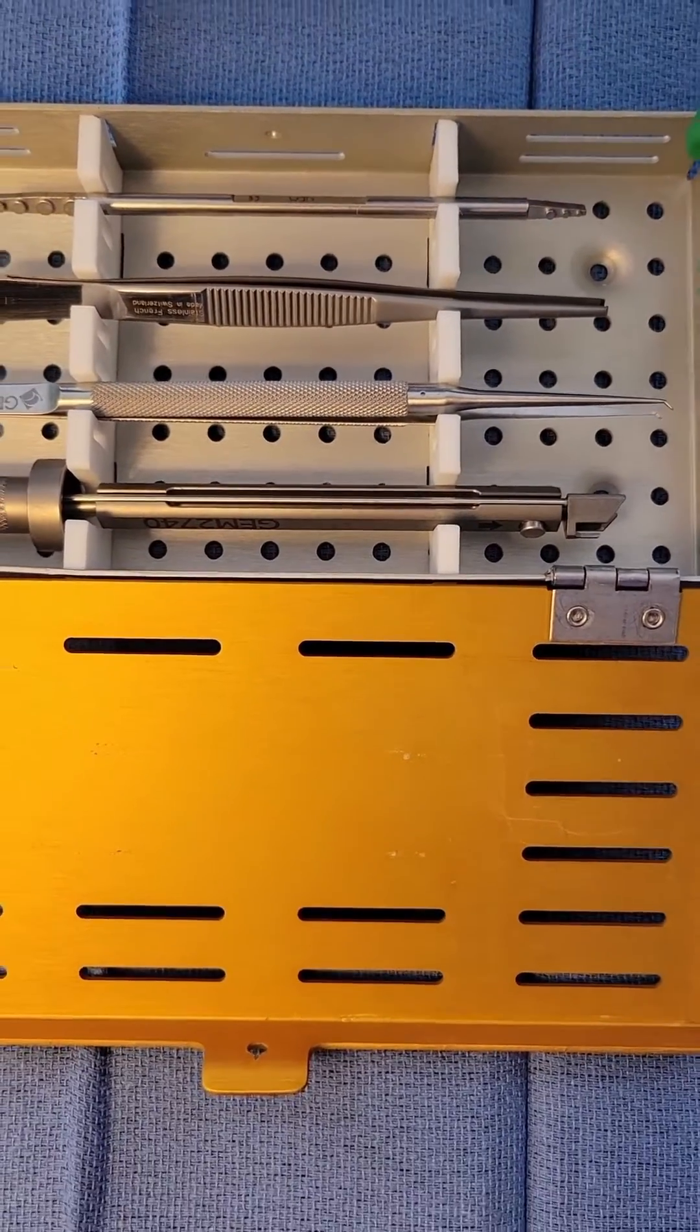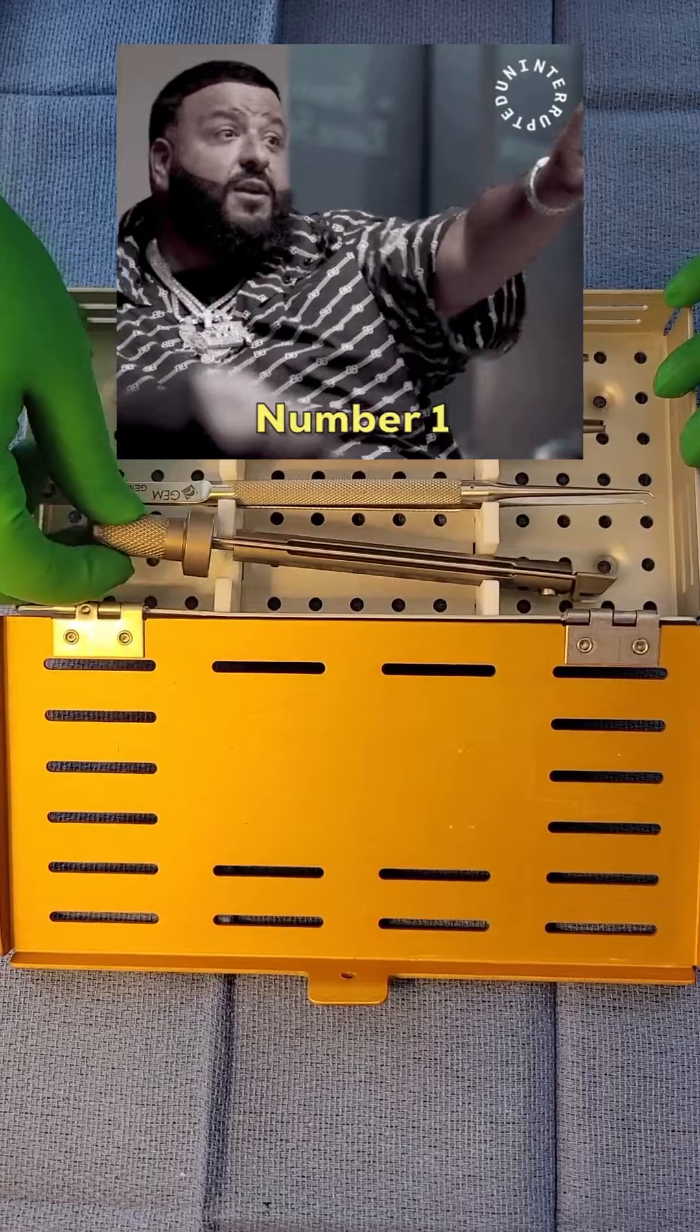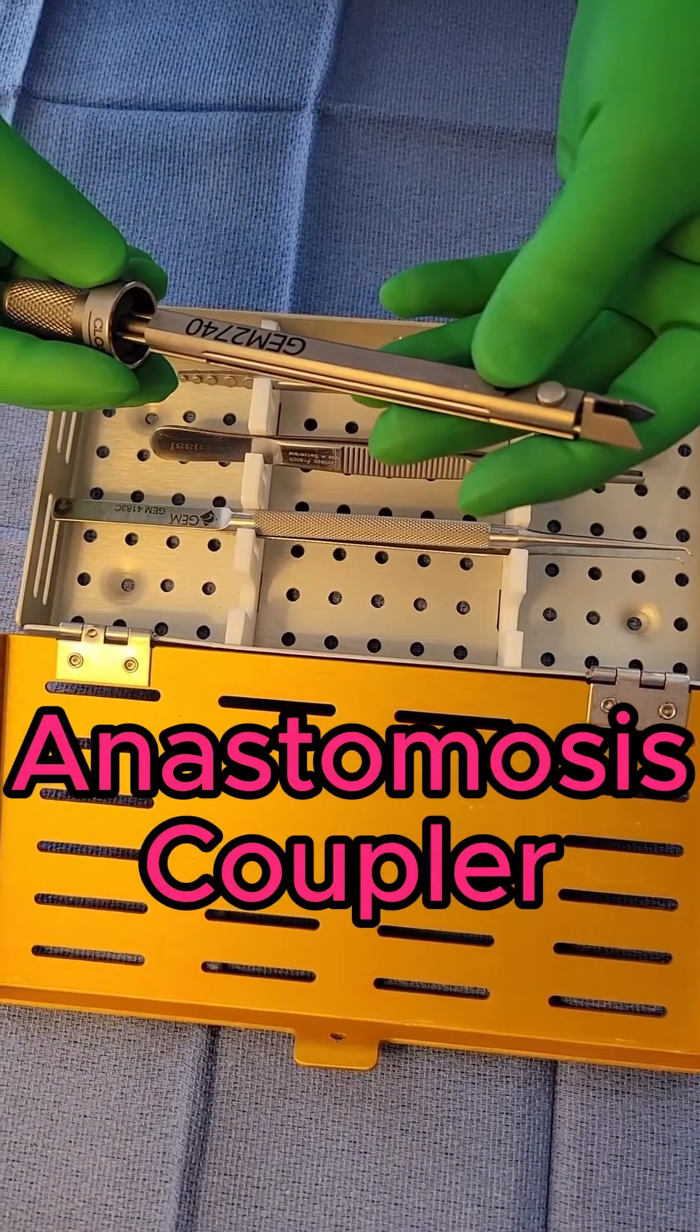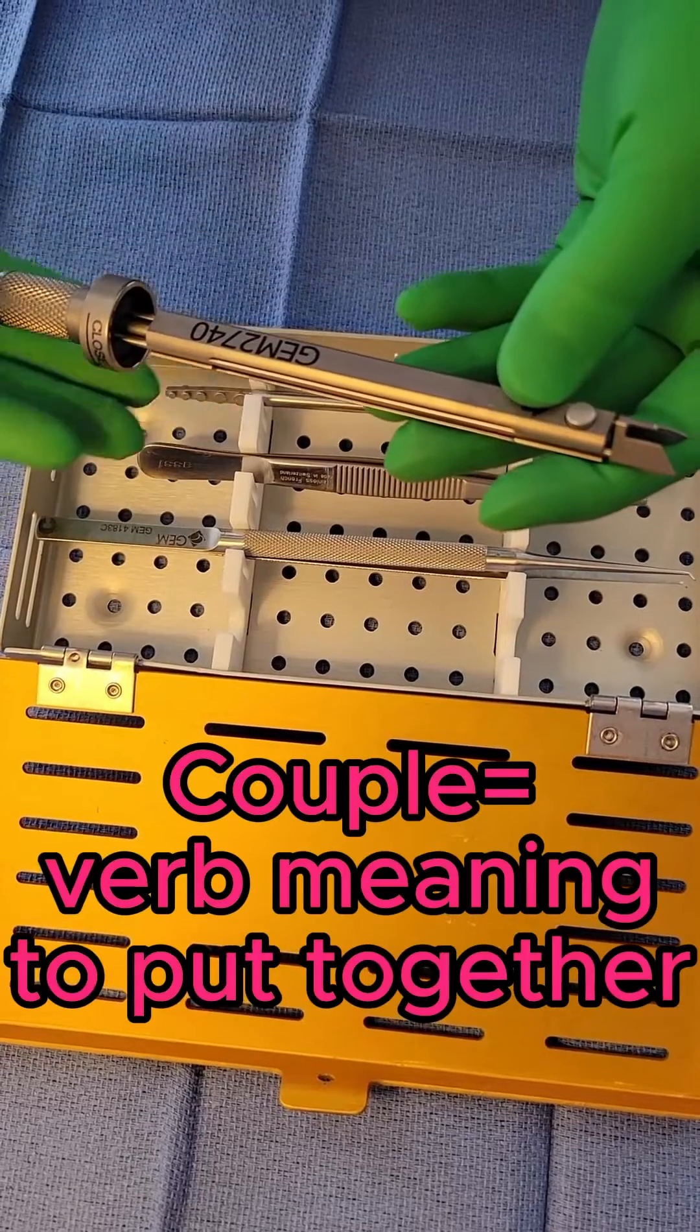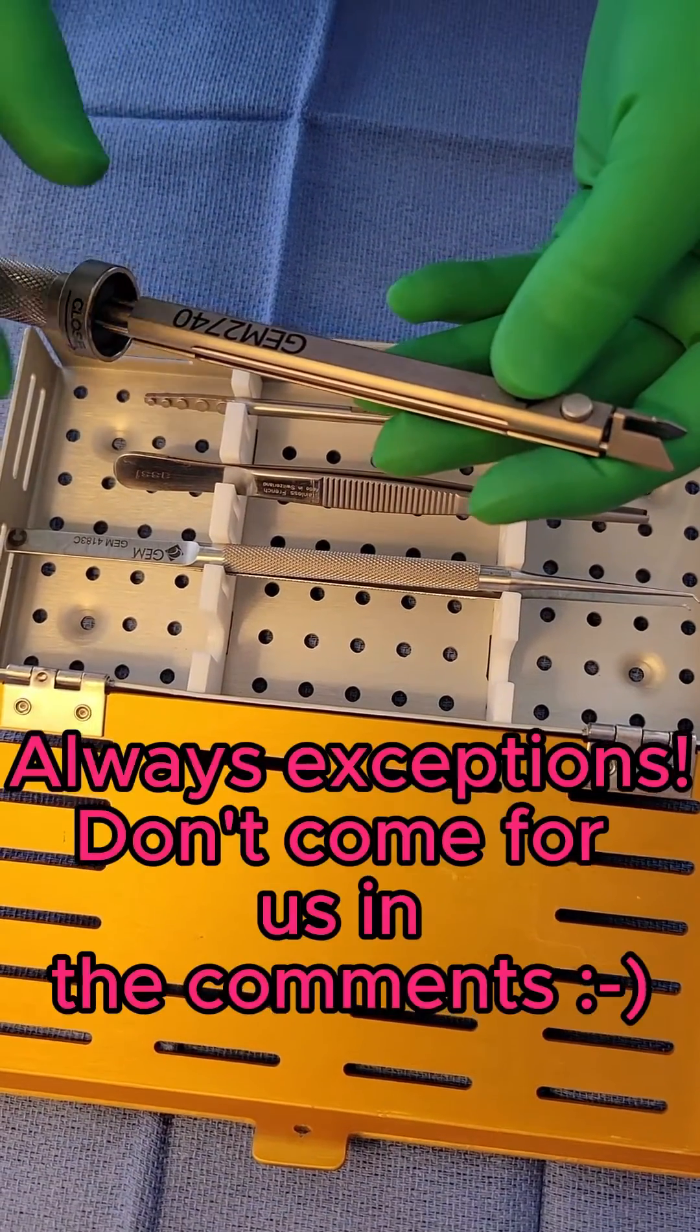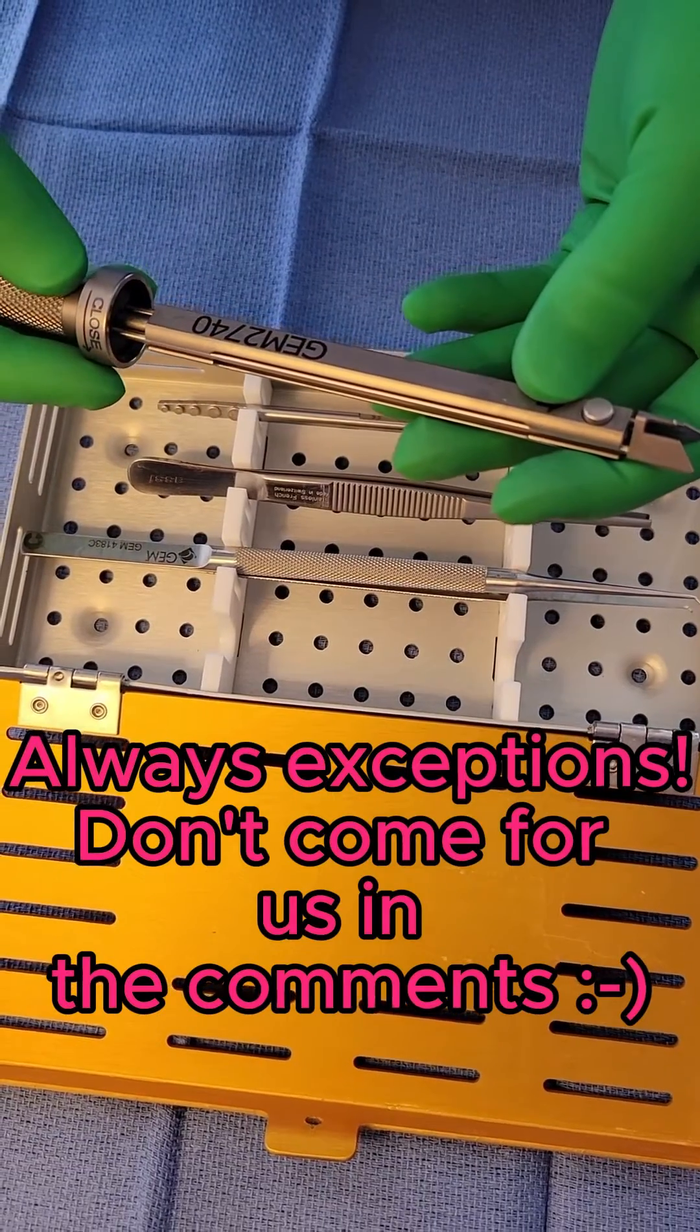This set typically comes in four pieces. The first instrument is the actual anastomosis coupling device. This is what is actually used to couple or put together the veins. I say veins because typically arteries are way too rigid to use this with, but some people do use it for that as well.